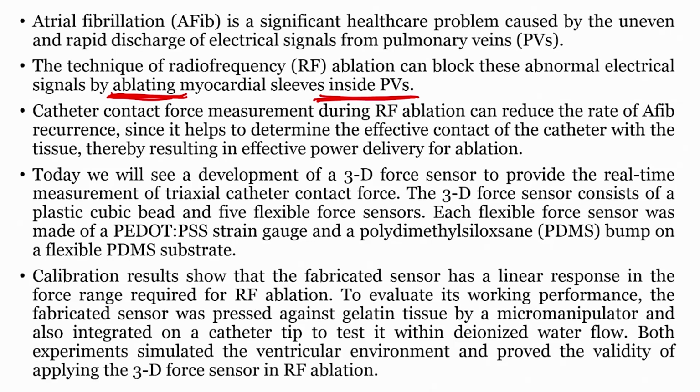Now, if this is the heart and if this is the catheter, we need to understand the force that a clinician is applying during the treatment.